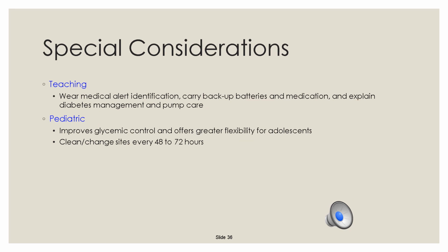Special considerations: you want to teach your patient to wear a medical alert device. They need to carry backup batteries and medication. They need to be able to educate and explain diabetes management and pump care. They also need to know that this has a battery, so they can't go in an MRI machine. And you never want to immerse the pump in water or expose them to x-ray films. Definitely not the MRI machine because it'll suck the battery out and it might pull their stomach with them, so not good.